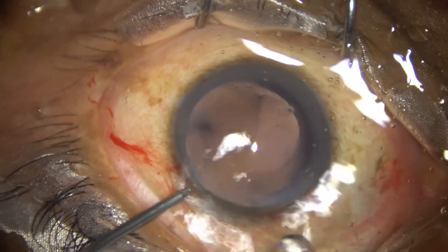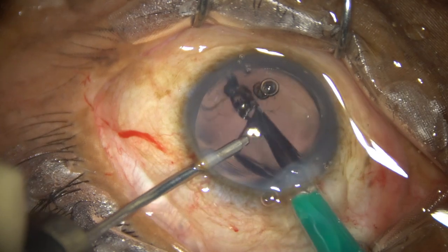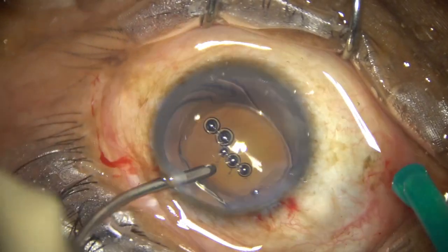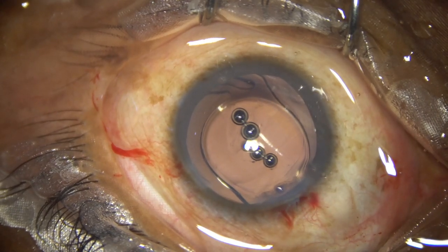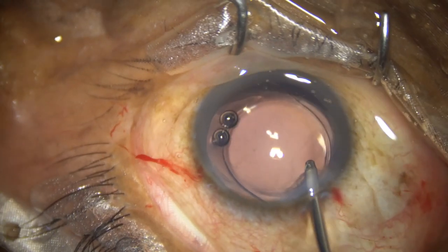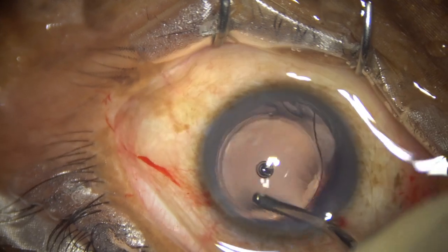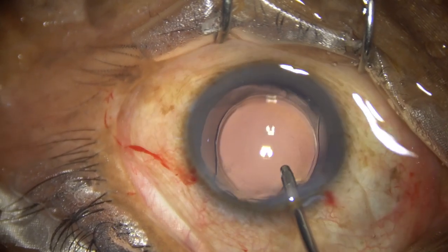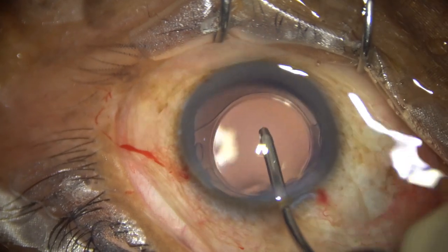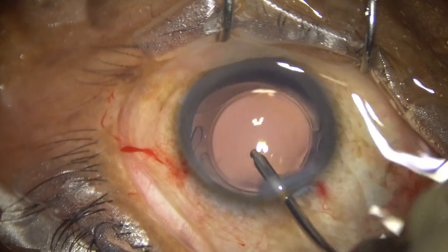Now this is hydro-implantation of a single-piece monofocal intraocular lens — a hydrophilic lens. In India we use a lot of hydrophilic lenses, depending on the financial capability of the patients. The anterior chamber is being irrigated to remove the viscoelastic that was in the lumen of the cartridge, and the implantation is done.